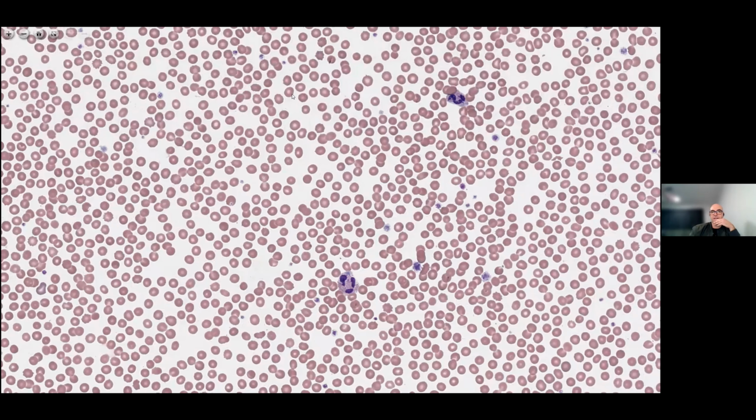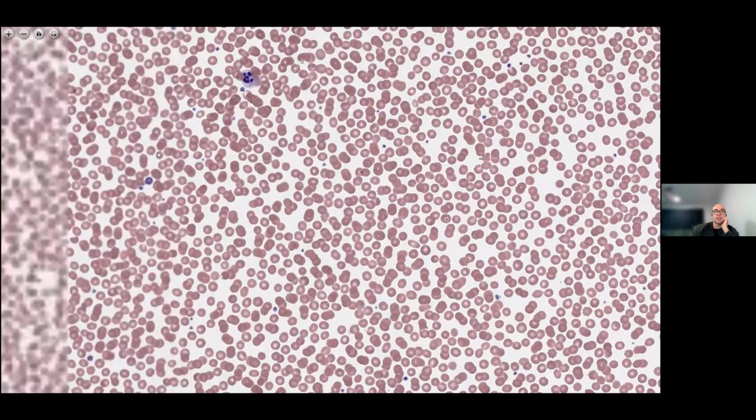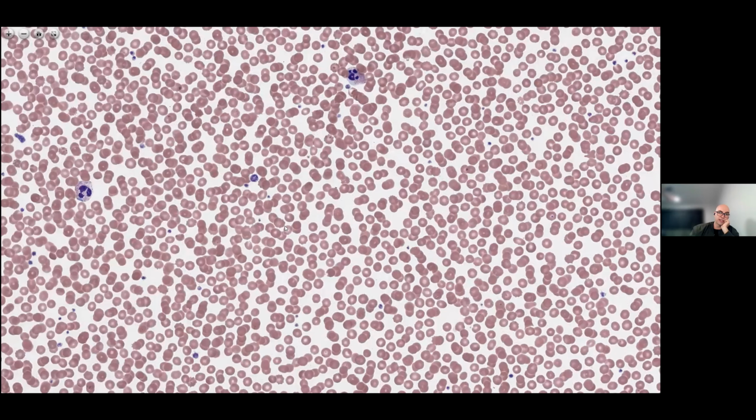So when a patient has a low platelet count, before you even start looking at the film, you can start thinking about what are some potential causes. A common cause of low platelets would be transient viral infection, which may cause a decrease in thrombopoiesis or usage of the platelets and aggregation of platelets in the body, and a decreased platelet count. And you may expect to see reactive lymphocytes. So reactive lymphocytes might be something to look for. Maybe in an infection or inflammatory process, you might get some sequestration of platelets and reduced platelet count.